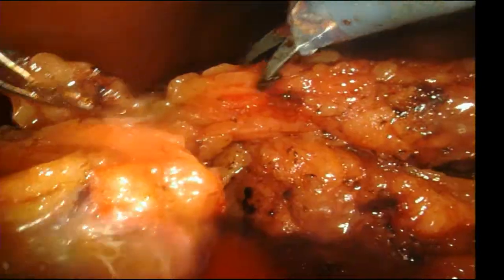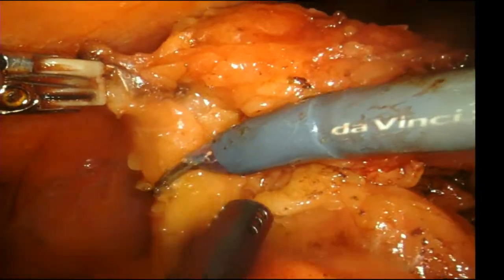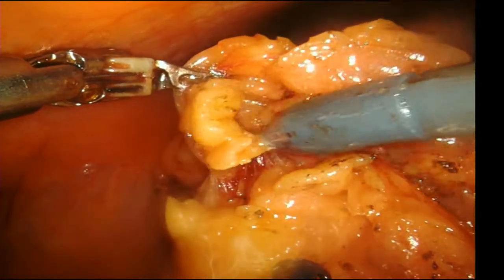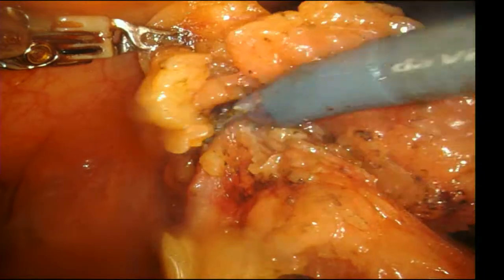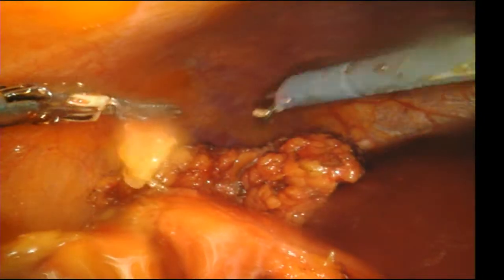So I typically will use the straight line, but I'll target the lower part of the kidney, though I don't think it helps that much. But sometimes on a nephroureterectomy, it does help if it's tough to get down to the pelvis, the minority of the time. Then I'll retarget lower, and it's a huge difference. Yeah, I think the target thing is not a bad thing. It's a good thing. But if people haven't used the Xi before, anyone in the audience who may not have an Xi, what you're going to find is that it's so much more nimble and flexible with port placement.